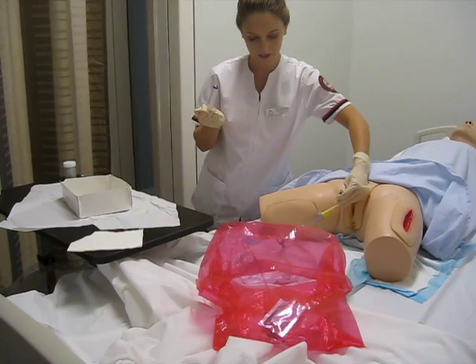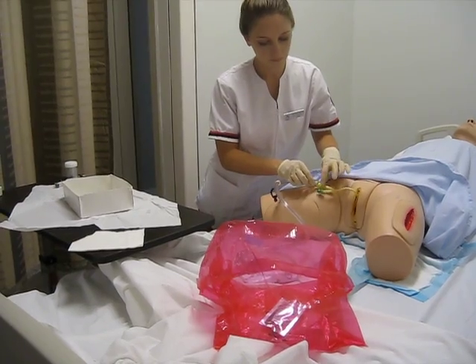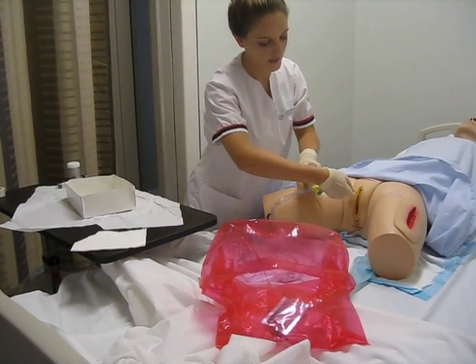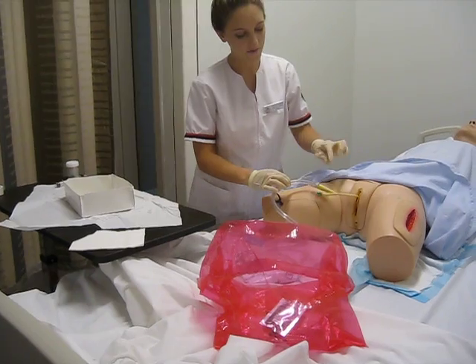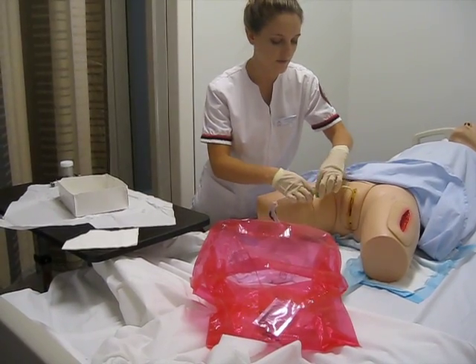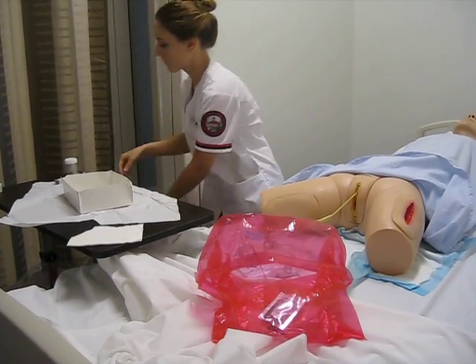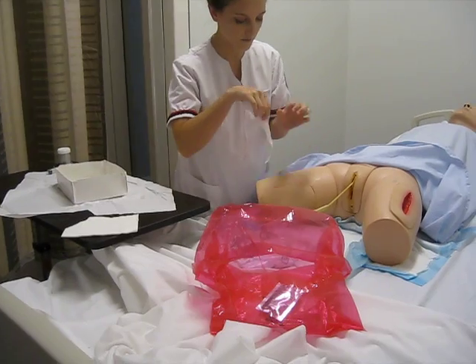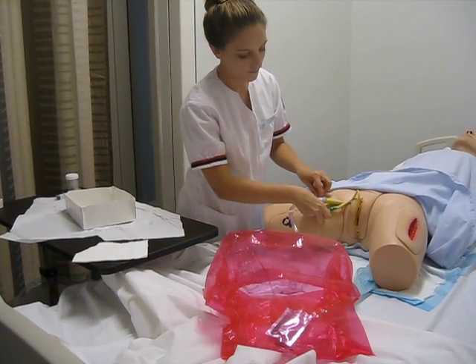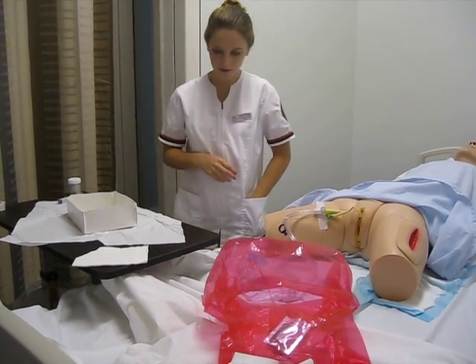Normally this would go in the sharps container. I will go ahead and give it a tug just to make sure it's where it needs to be, and it is. I will now tape the catheter to the patient's leg after I remove my sterile gloves. This is just easier to do without gloves on, and you want to make sure it's not laying flat on the patient's skin. I'll wash my hands and put on some clean gloves.